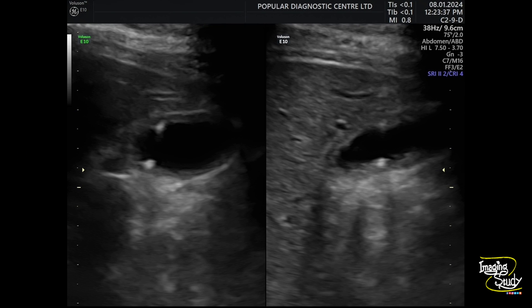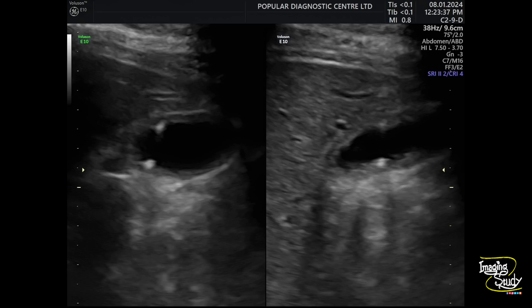Now I have changed the transducer and magnified a little, and you can see some echogenic foci within the thickened portion of the gallbladder wall. It apparently looks like tiny calculi, but these are echogenic foci within the gallbladder wall. We tried to use a little more high frequency but it was a little difficult to see the gallbladder with the linear probe in this case.